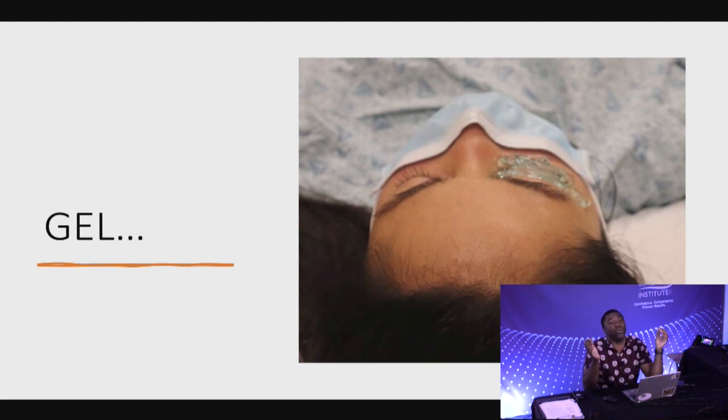When in doubt, just throw some more gel on it. The more gel, the better. So there are two different ways of doing this. One class is throw a Tegaderm on it, make the patient more comfortable, because sometimes if the patient opens their eyes mistakenly during the exam, the gel in the eye gets a little bit uncomfortable, and then the patient starts cursing. You don't want that.